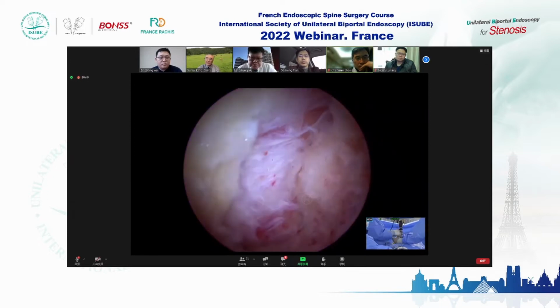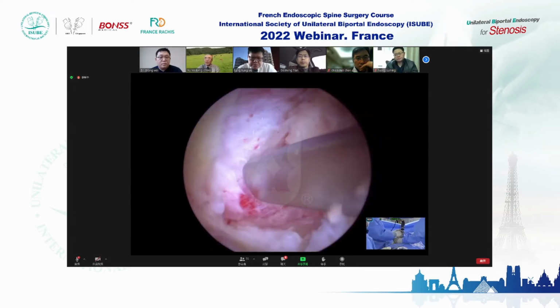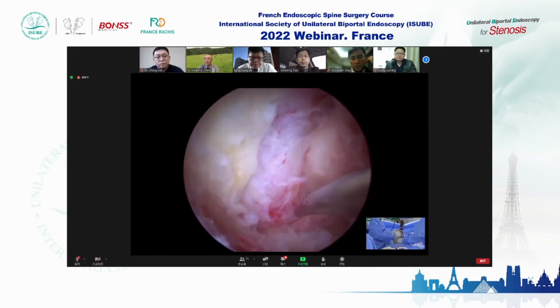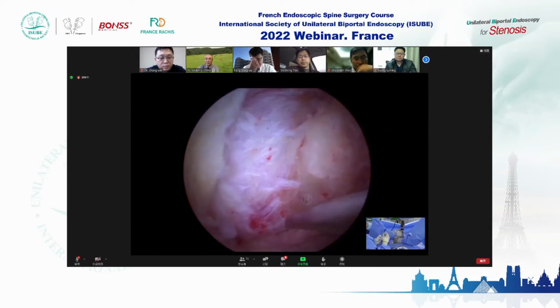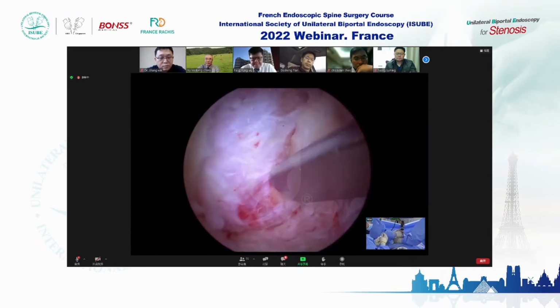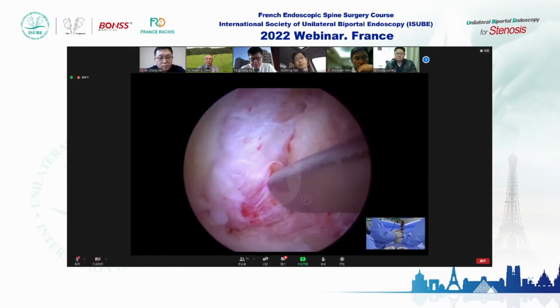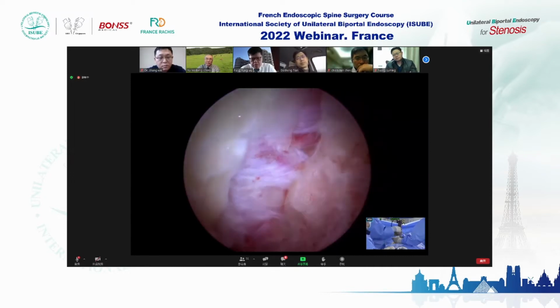Okay, again. This root lies just here. Pedicle, lateral surface of the pedicle, the lower pedicle is thus the true real course of the root. Okay, you see it here. This root, I don't touch, I don't remove the connective tissue and vein and other tissue. That I finished. This root is fully decompressed.